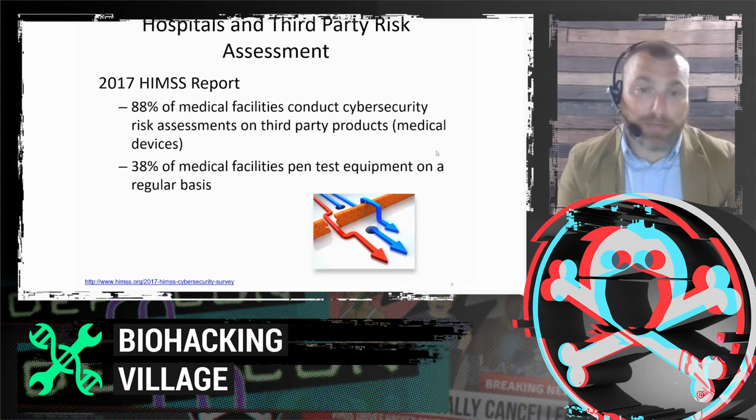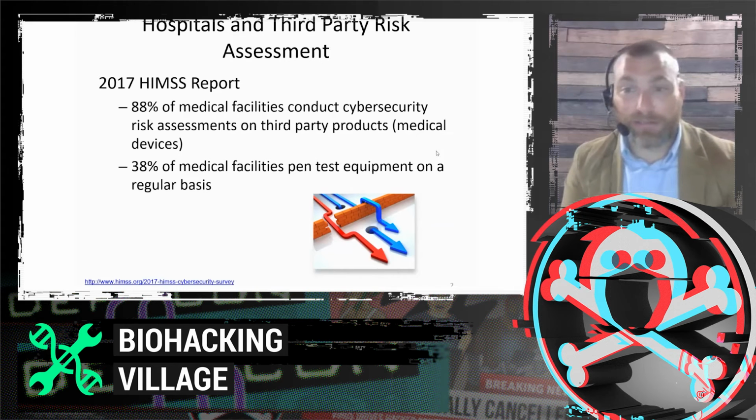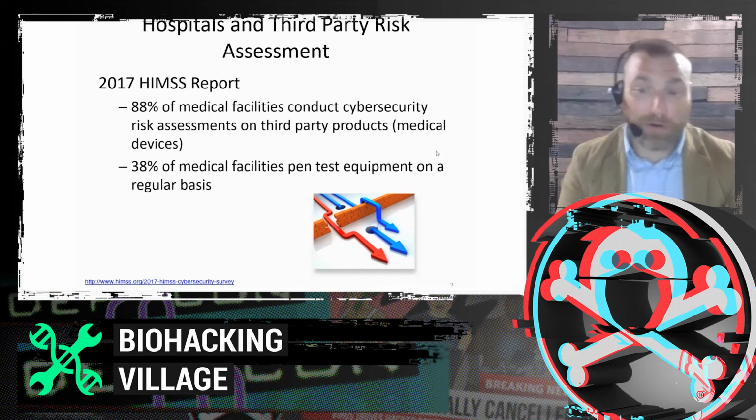And 38% of medical facilities are pen testing equipment. So if you're a medical device manufacturer and you're not pen testing your equipment, be aware that your customers most likely are pen testing, or at least are going to ask if you are pen testing.